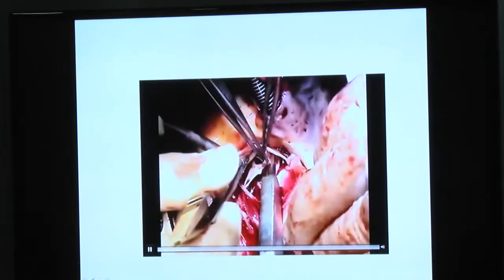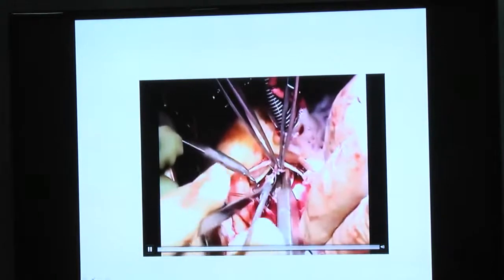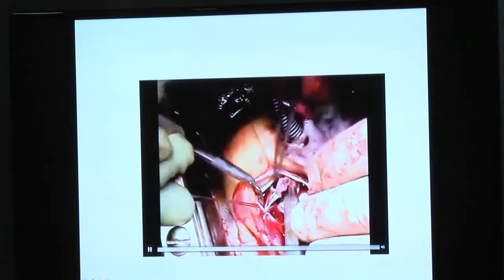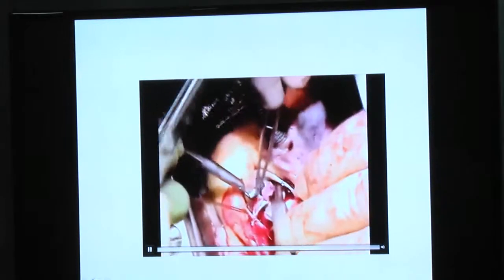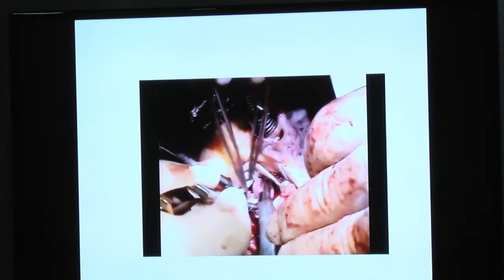Now, coming to the surgical exploration, when we see here, you can make out the surgeon is operating in the vicinity wherein there is a tear in the right coronary cusp, and he is suturing that. This was the reason. Probably while he underwent an angio during his inferior wall MI, probably the catheter perforated the right coronary cusp. That's why it led to an AR.